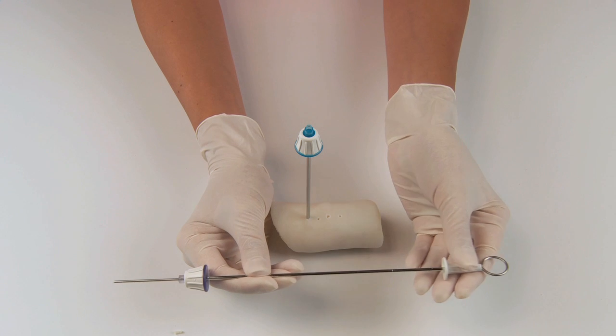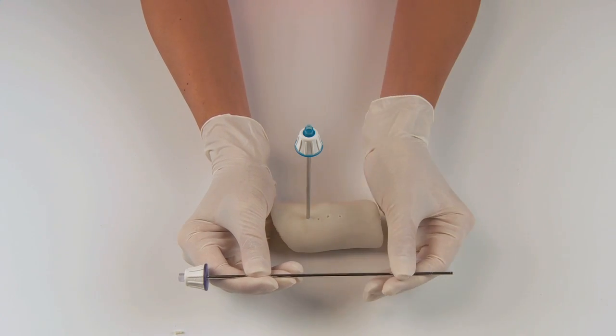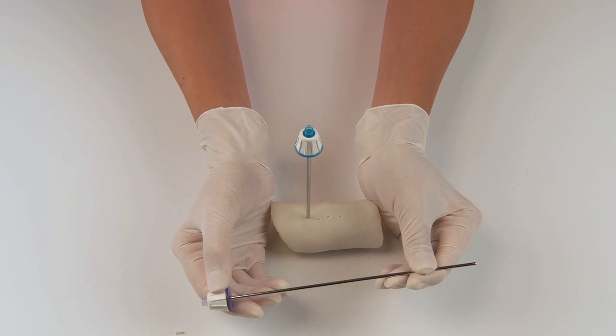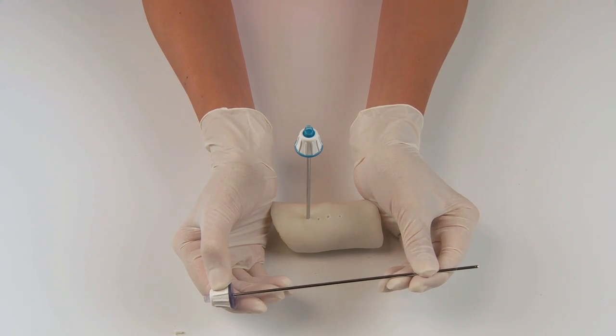It is important to note that the biopsy cannula is shaped like a cone. Therefore, the sample is pushed out through the lower opening of the cannula hub in order to avoid crushed artifacts.